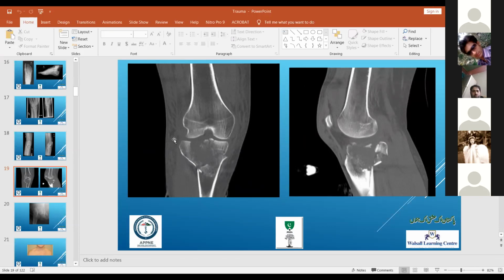Okay. So if you don't know how to put an Ilizarov frame, somebody like me who does not know anything at all, what am I going to do with this? So spanning external fixator. Okay. So in the exam, the word you're going to use is span. You span it. Do you understand the words? Span it. Yes. You span it. You scan it and then you plan it.